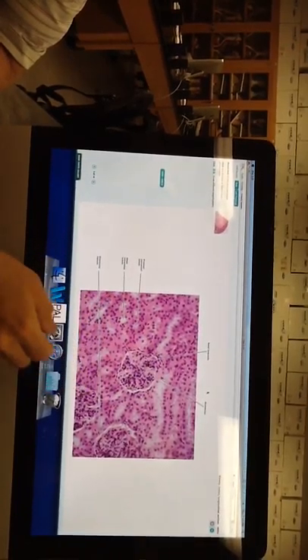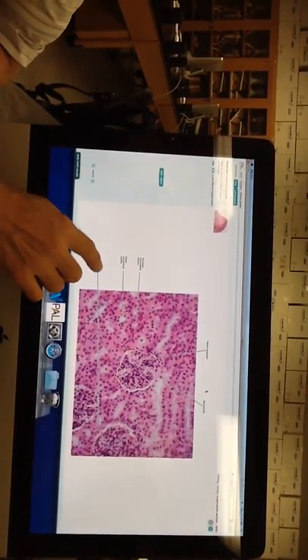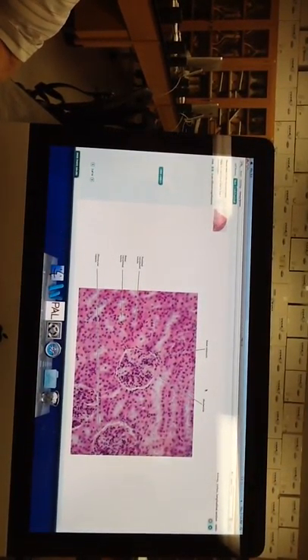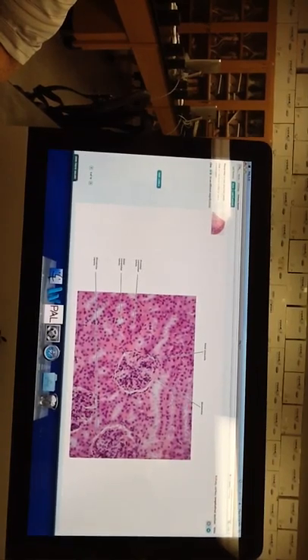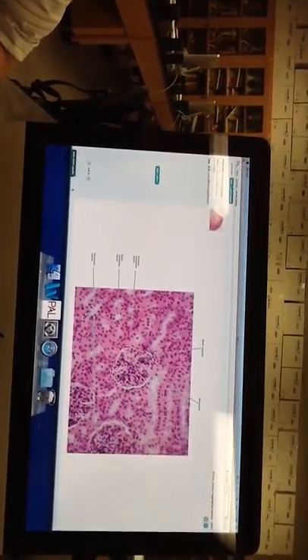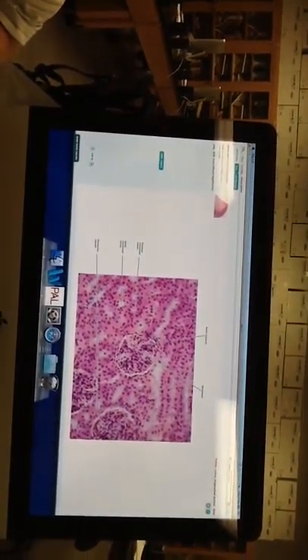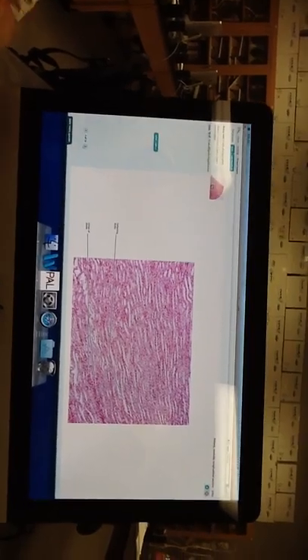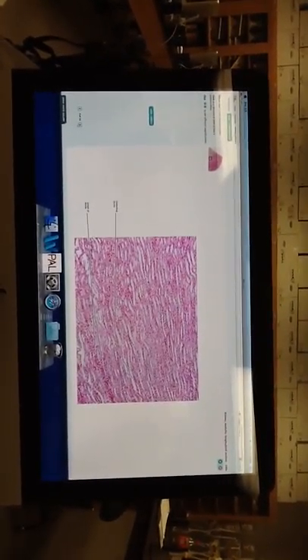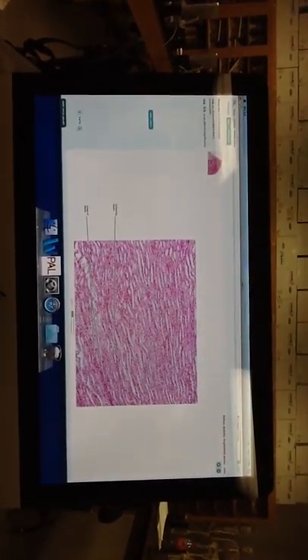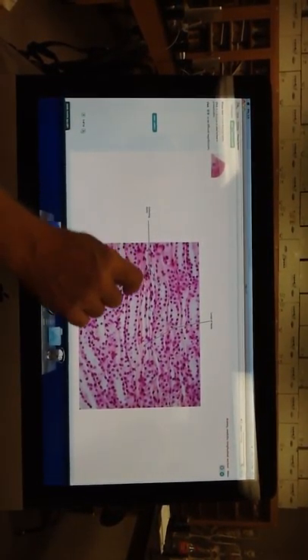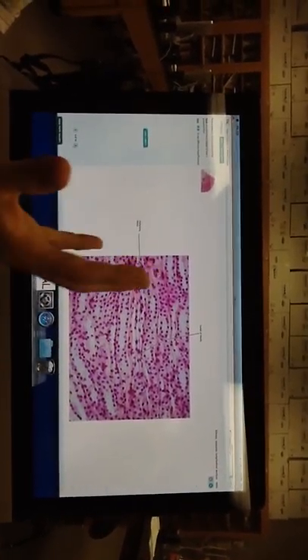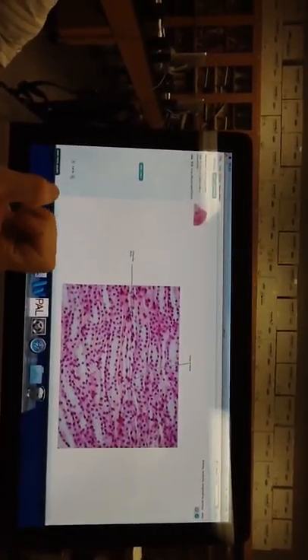That's up close, a glomerulus. At high magnification, you can see how it's got its own kind of... It's bound by almost a little bit of a capsule around it. That's why it's sometimes called the glomerular capsule or Bowman's capsule. And it's a big wound-up ball of capillaries in there.